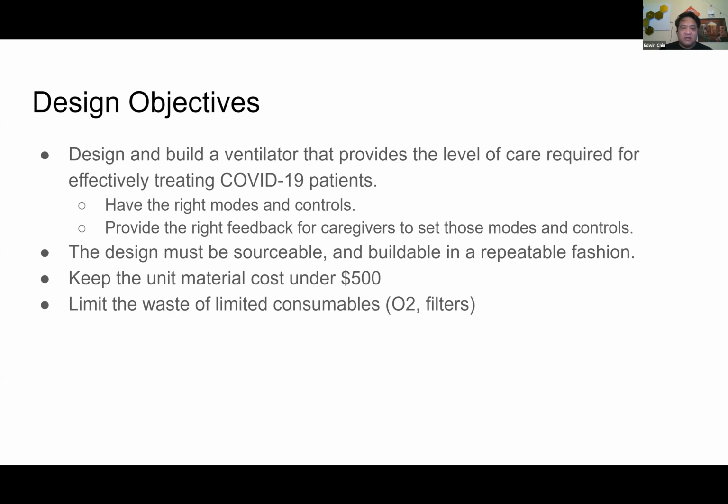A lot of the other designs out there are bridge designs. They're intended to help keep a patient alive when they enter the hospital, but they will most likely end up being transferred to what is considered a full-featured ventilator. So we want to build a ventilator that has those features, so that we don't end up just taking up another ventilator eventually. The design must also provide the right feedback for caregivers to be able to set the course of treatment to bring people all the way back to recovery.